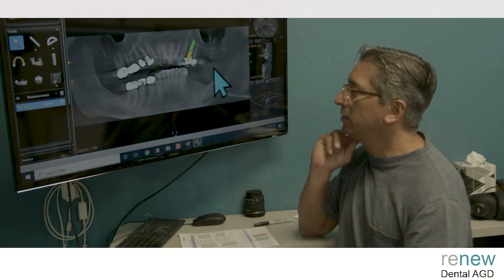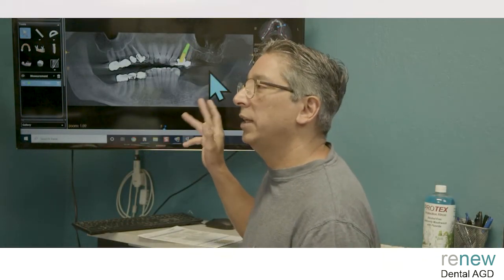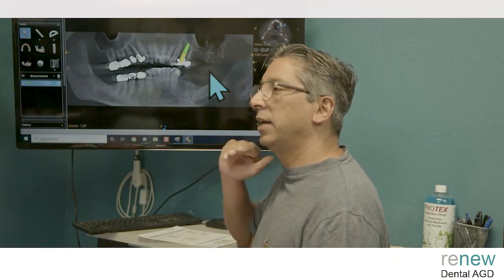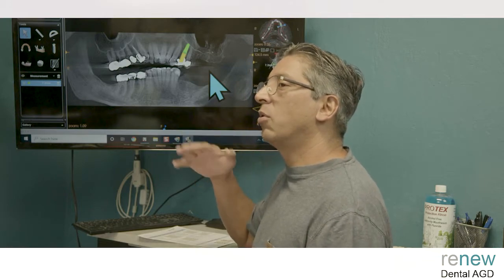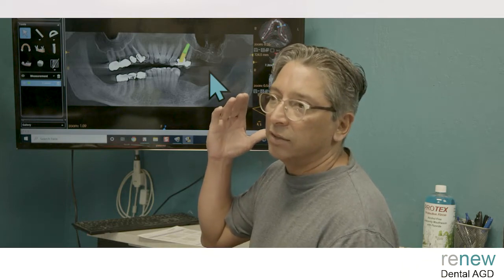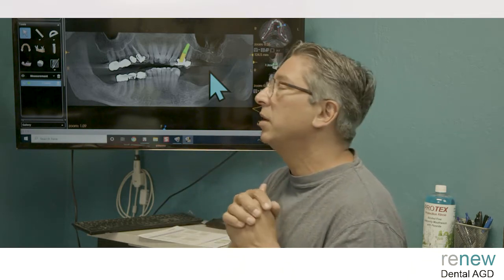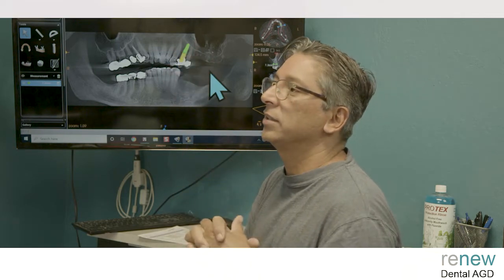I like the case. This isn't a real beginner case at all. This case is going to be somebody that is getting to some more advanced techniques where they want to do sinus bumps, crestal approach type stuff. You want to challenge yourself maybe with an immediate placement one. If you've done a number of them, that would be this case.